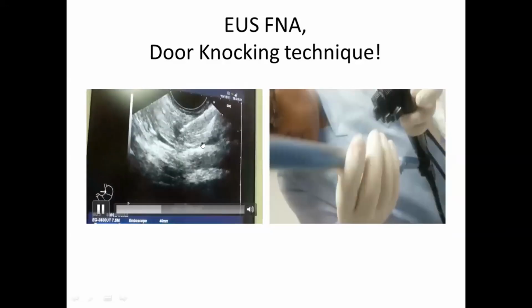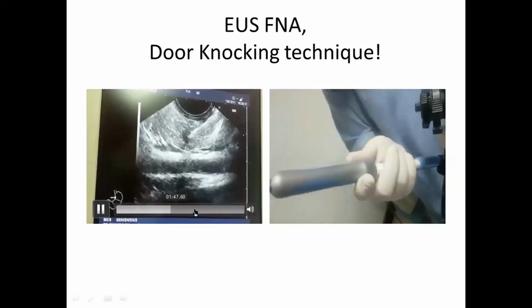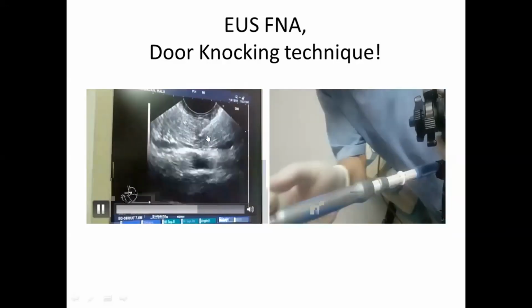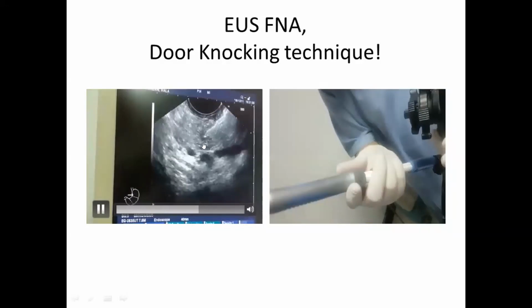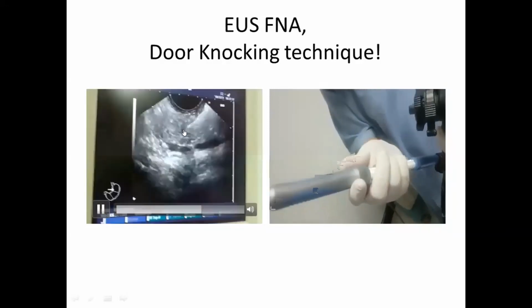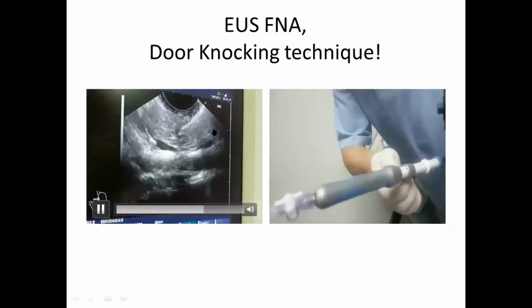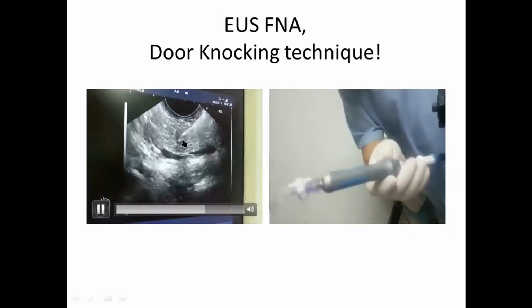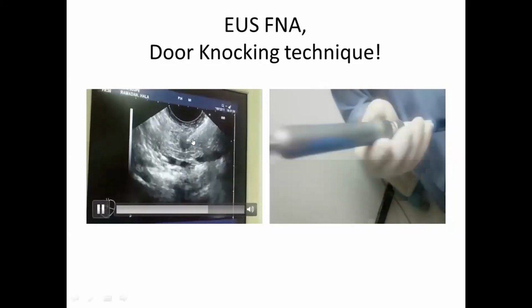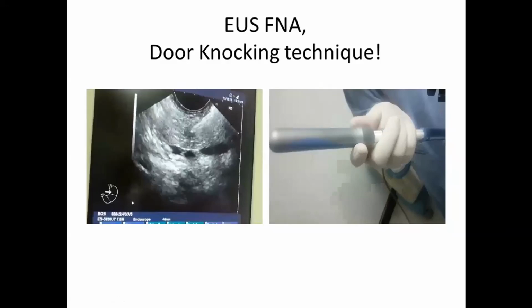We tried several times, and as you see with me here, after applying the door knocking technique, the needle now starts to move inside the mass, and not shaking or moving the mass as a whole. Concentrate on that video. You notice now that we start to move inside the mass.